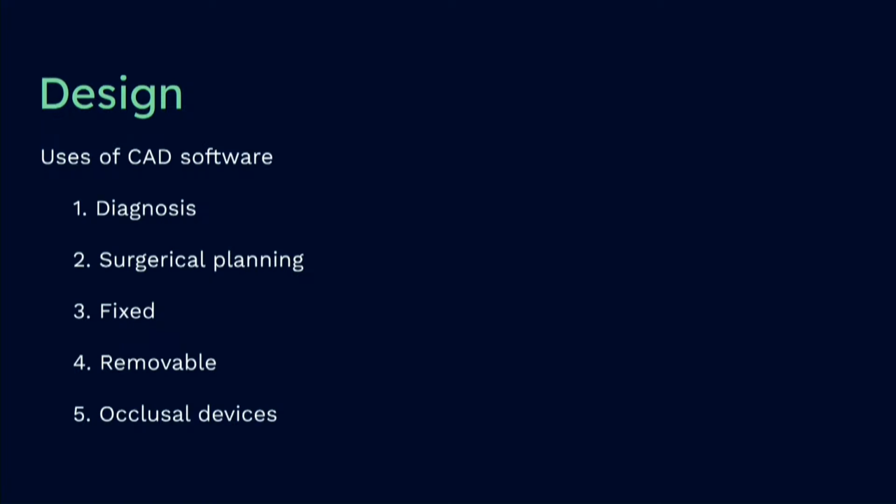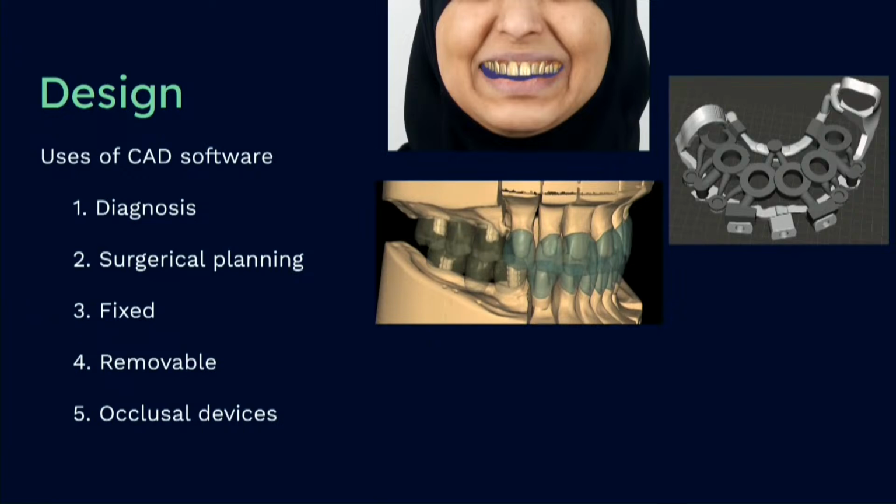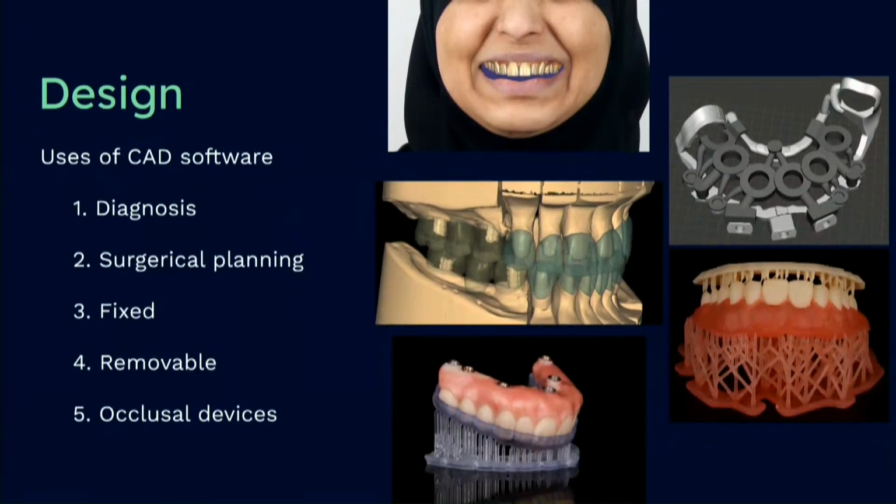Following proper digitization of your patient, design comes next. Design softwares are vast, which makes them present a steep learning curve, but that also makes them collectively capable. Such softwares, generally speaking, aid in diagnostic workups, planning surgical procedures, fixed and removable treatment modalities, as well as occlusal devices like night guards and mandibular advancement devices for sleep. It is worth mentioning that we are at a day and age where anything you could think of and in any material can probably be achieved with a digital approach one way or another.